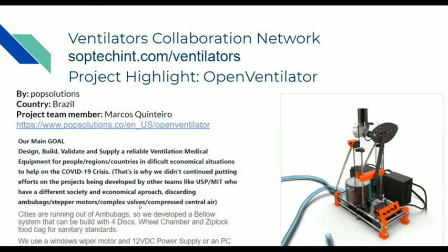The problem is not pressure, because if you put, I don't know, 2 psi of pressure, but you maintain a volume that's lower than the patient's lung capacity, you won't hurt him.